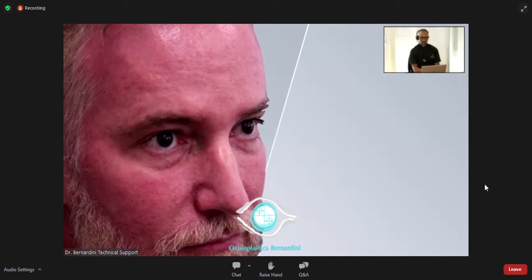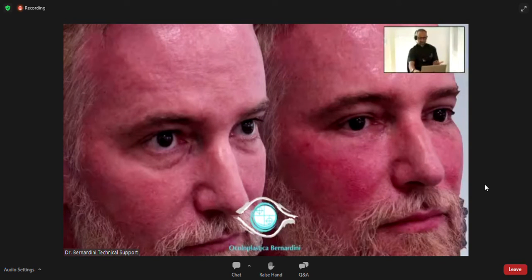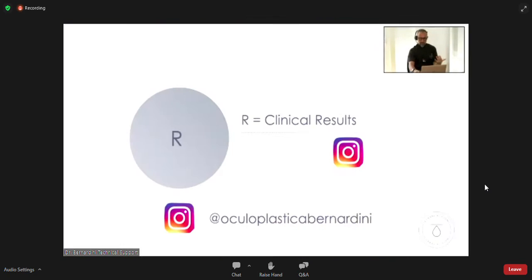Here is to show you an over-injected mid-facial patient, where the product did not get into the right places, showing even worse demarcation between the eyelid and the mid-face. After my revising it, you see that it's not more filled, it's just more lifted, and the defect has been erased.